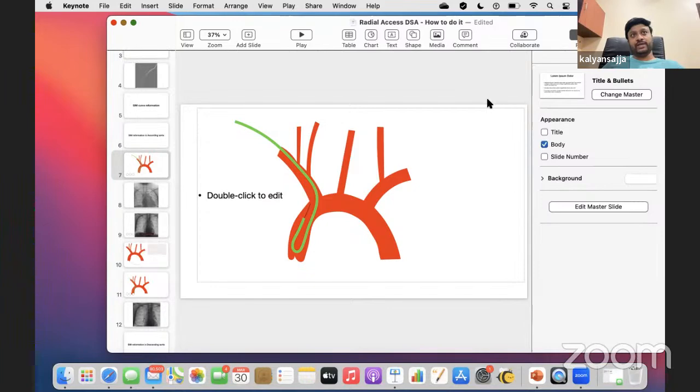Soft, it goes up to the petrous, sometimes even more than petrous, but I'd recommend staying at the petrous, not going too high up. What do you suggest regarding stroke intervention, sir? Because we are well versed with radial. The temptation is for stroke also, at least for the right-sided strokes, maybe to go through radial. Is it? Yeah, right side is easy.